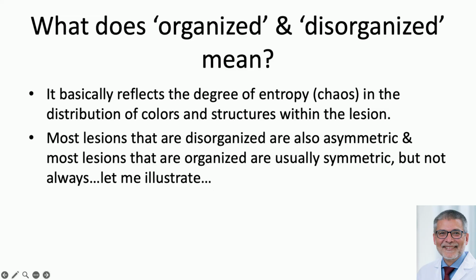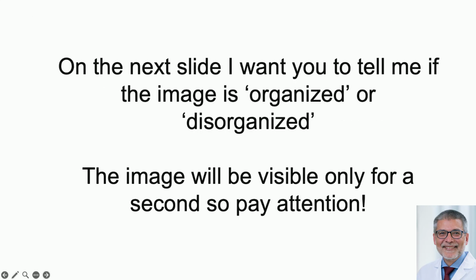But I want to give you a heads up on what I mean by organized and disorganized. It's not the same as symmetry and asymmetry, okay? It has to do with a very different process of thinking, but we all do it, and I will show you what I mean by that. So I want you to take a look at the next slide and pay attention, because it'll only be up for a millisecond, and I'll ask you if it's organized or disorganized.